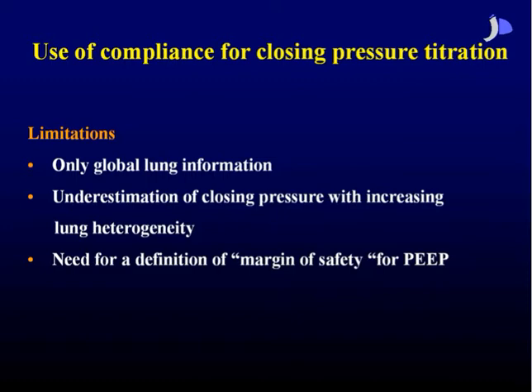Go ahead. Yes, Tenonen from Finland. As you pointed out, it's quite difficult to set the limits, really. I mean, how high you can go. But my opinion is that you always have the other side, which is hemodynamics. You have heart-lung interaction, and you should always also consider blood flow, systemic blood flow. Another point of view is that you should ventilate, to get rid of CO2 to some extent, okay? Yes.